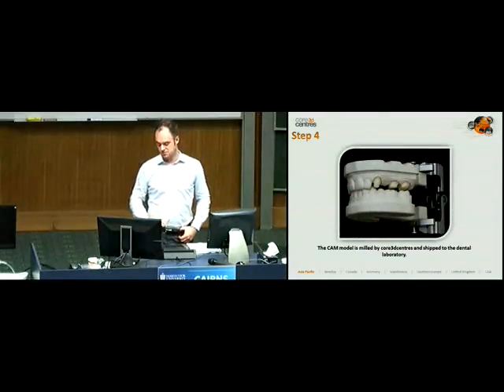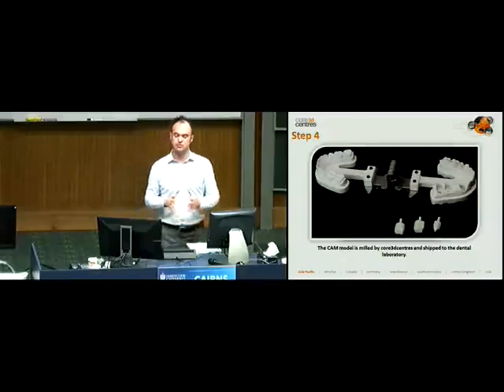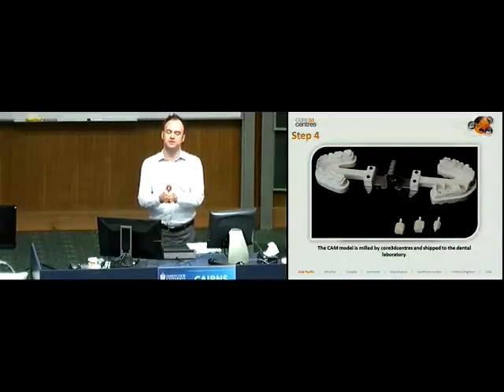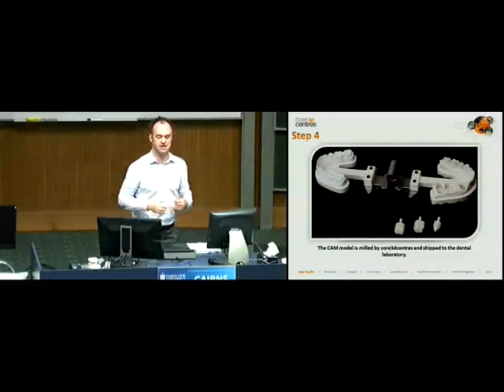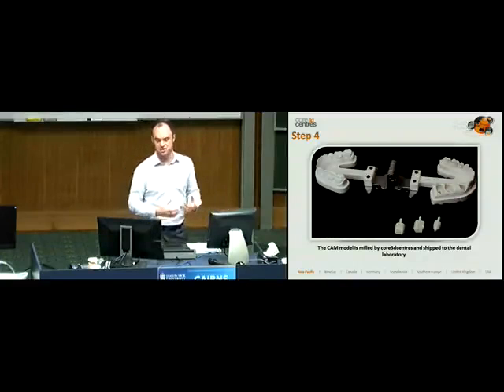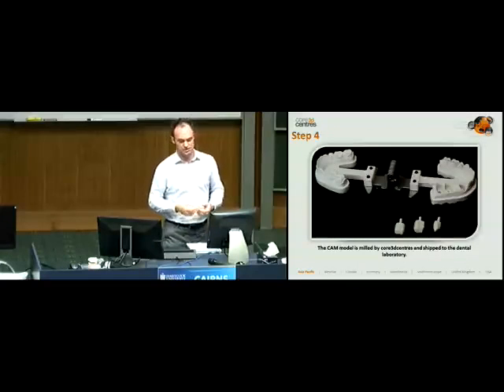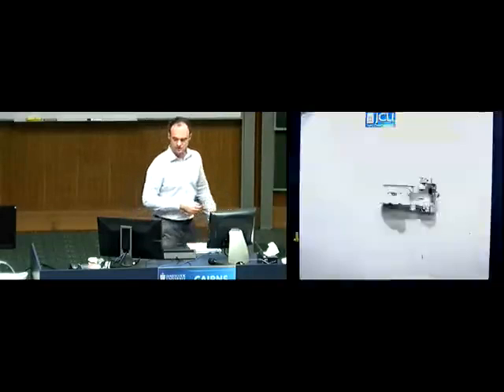But once that's milled, the removable dies are there, it's sent to the laboratory. So you've got to remember, although I'm talking about digital technology, we're still producing a very accurate model that any laboratory in the world can use, and that's the key. There is a way of using the data digitally throughout the whole of the workflow, but if you want, this is a really nice way of dipping your toe into digital technology without having to get into too much about dental design software. So I'm just going to switch to this document camera because I've got a model here.